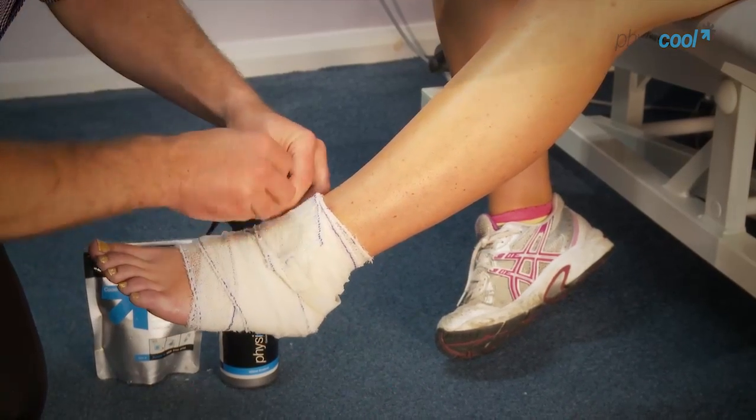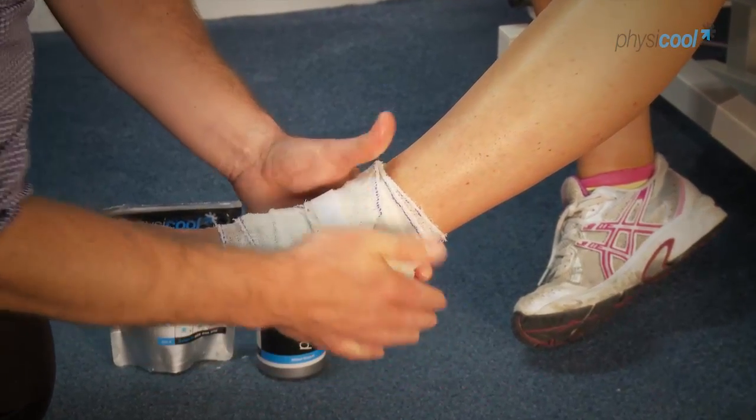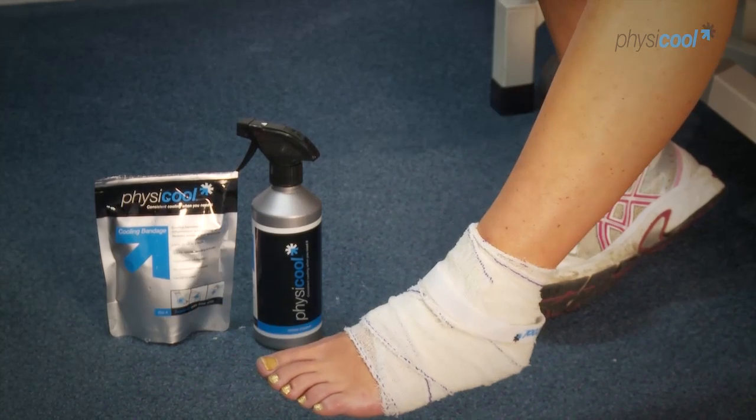There's a Velcro strap which we unravel and then reattach to itself. And with that, the bandage is on — you'll start to feel the cooling effect in just the next few minutes.